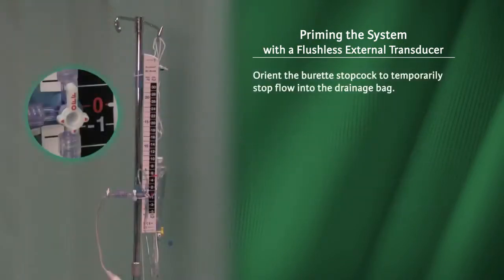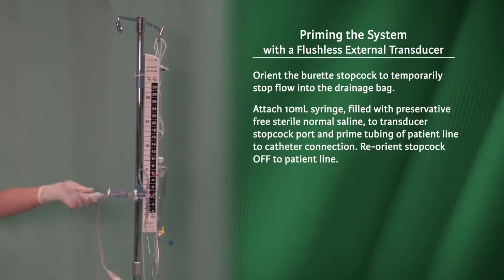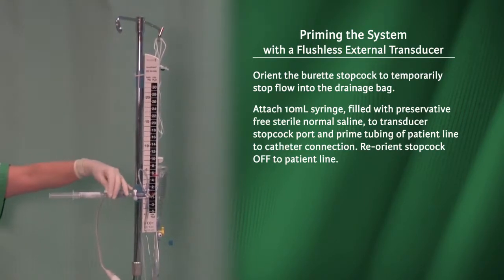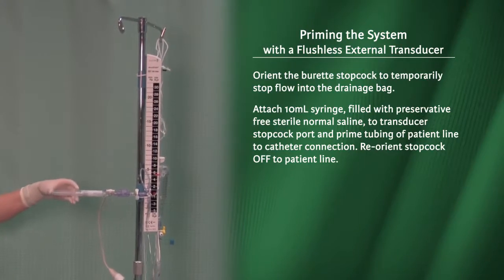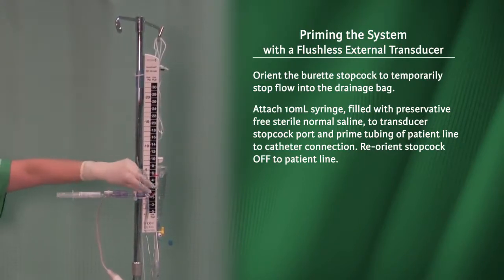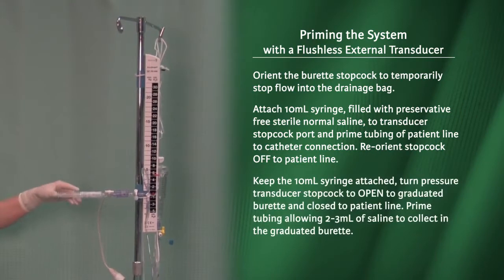Orient the burette stopcock to temporarily stop flow into the drainage bag. Attach the 10 ml syringe filled with preservative-free sterile normal saline to the transducer stopcock port, and prime the tubing of the patient line to the catheter connection. Reorient the stopcock off to the patient line. Keep the 10 ml syringe attached.